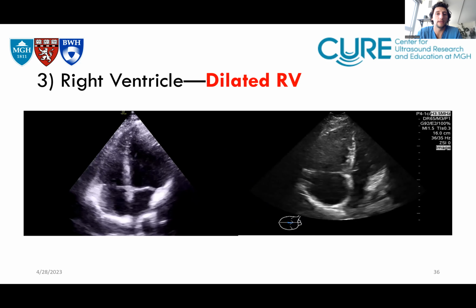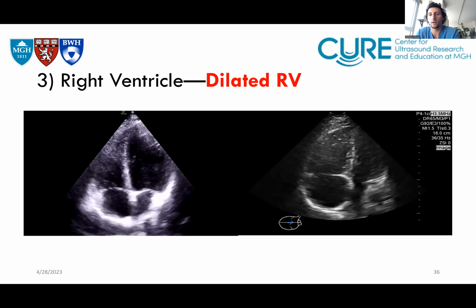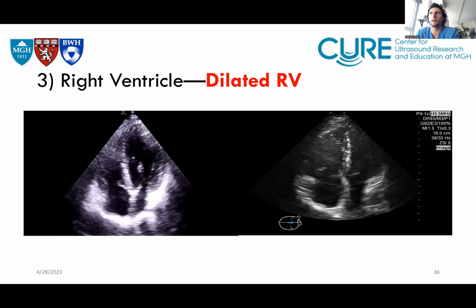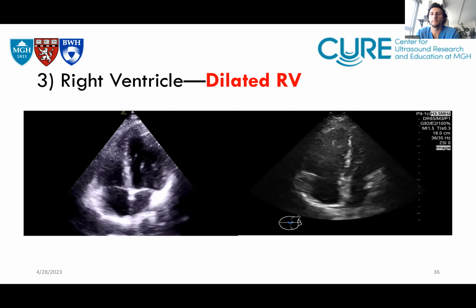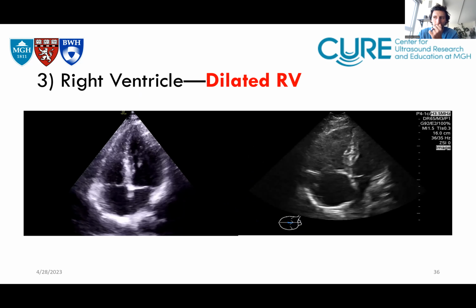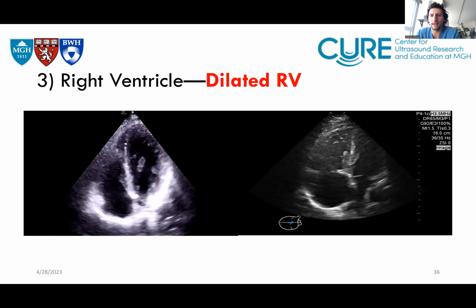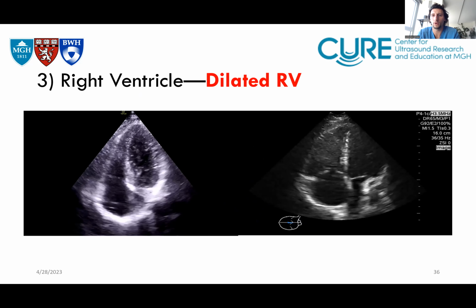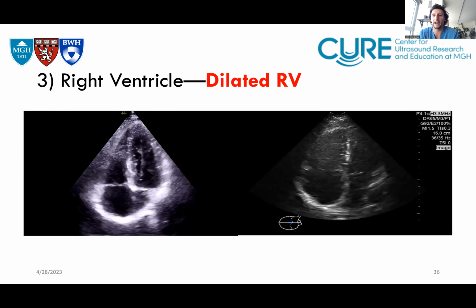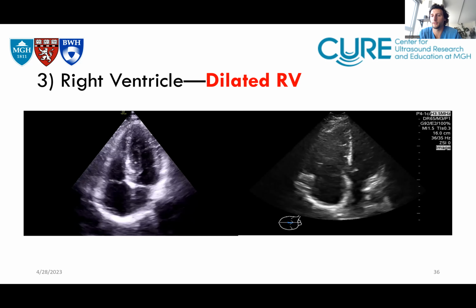And now here is something a little less normal. So look at the one on the right side. You're looking for a left ventricle that's bigger than the right ventricle. That's a normal situation. Should be a little less than 1-to-1, right? On the right side of the screen, I can't even tell which one is the right ventricle, which one is the left ventricle, because they both look so big. In fact, the one on the left side of the screen looks even bigger than the right side of the screen.